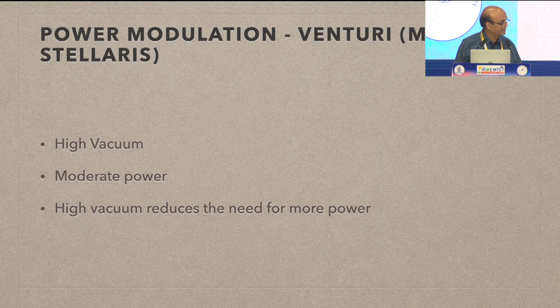Recently I was doing a bit of a study, like I was checking, my machine has got a dual linear control also. So dual linear, I go up to 330 millimeters. When I went up to 330, even in a grade 5 cataract, I could emulsify the nucleus in 25 to 30% of the phaco power. But when I am just going in the linear mode at 200 millimeters mercury, I could emulsify at 55 to 60% power. So it's always better to use a high vacuum while emulsifying the nuclear fragments.